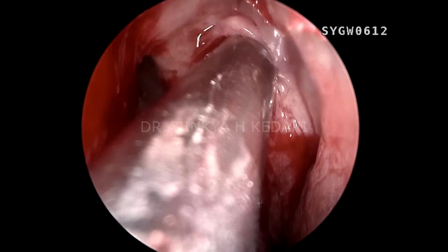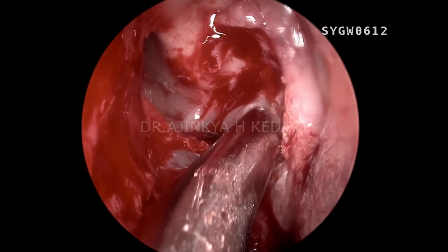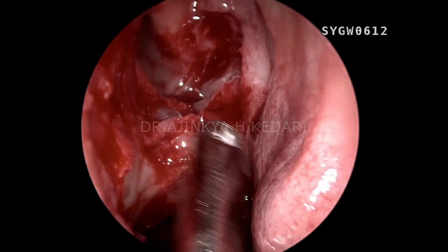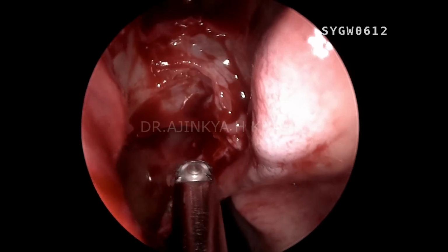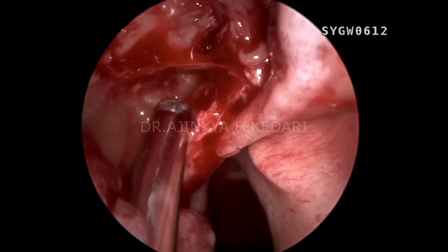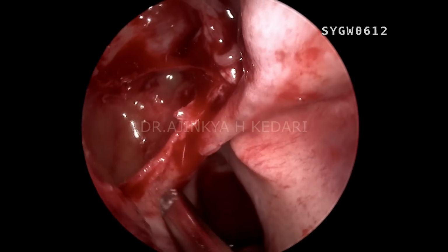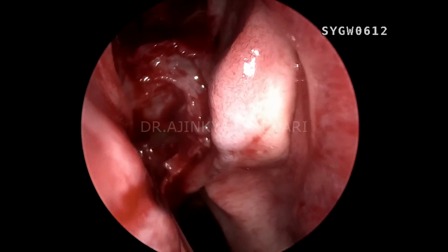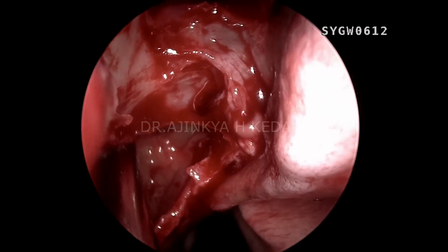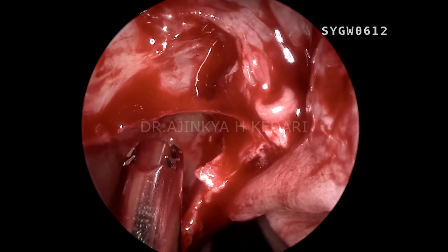So I'm almost towards the skull base above. That's the part of the superior turbinate behind. So I'm going to go medial to the middle turbinate and try to open the sphenoid sinus. I'm going to show you how to approach and perform that particular technique. That's the posterior most part of the middle turbinate, where the sphenopalatine artery will arise from just behind the posterior wall of the maxilla, above and behind the crista ethmoidalis. So my aim here to open up the maxillary sinus is to locate the floor of the orbit as a landmark.